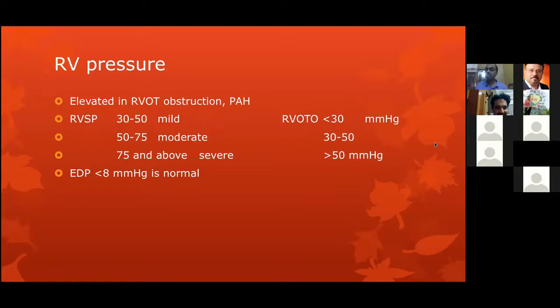Why do we generally grade PS by peak pressure, but AS by mean pressure? AS also is recorded by peak pressure. AS more than 64 peak pressure and 40 mean pressure is considered severe. Pulmonary stenosis, since it is a lower pressured pulmonary artery chamber, often the clinical significance is given only for peak pressures. It is basically lower numbers. Severe aortic stenosis with left ventricular pressure is going to be touching 200, whereas in severe pulmonary stenosis, right ventricular pressure will be touching 70.